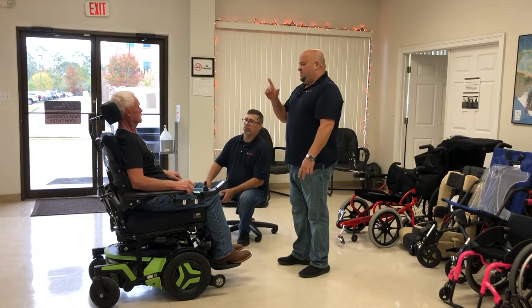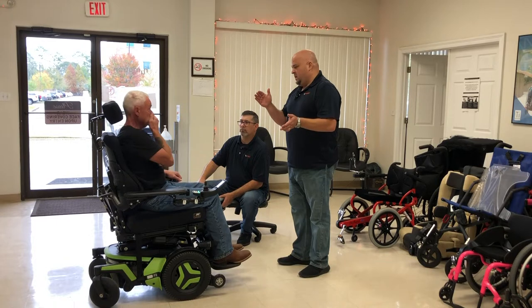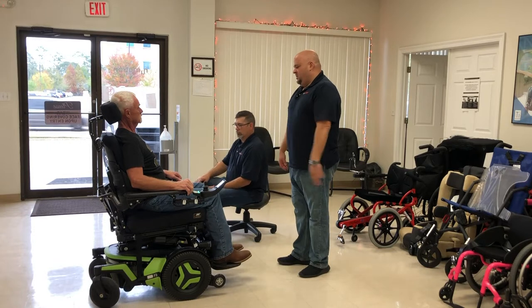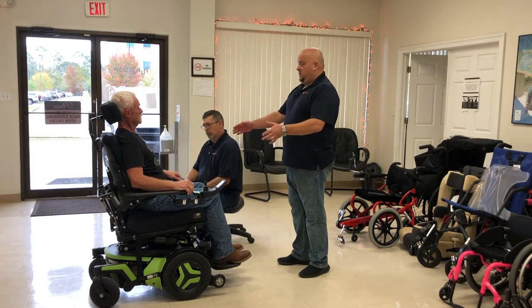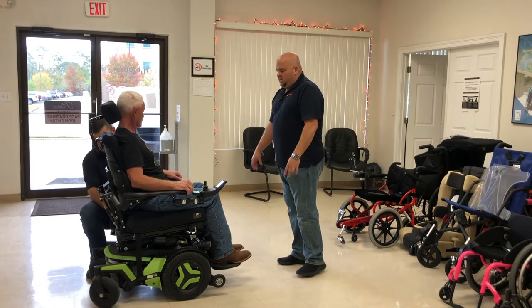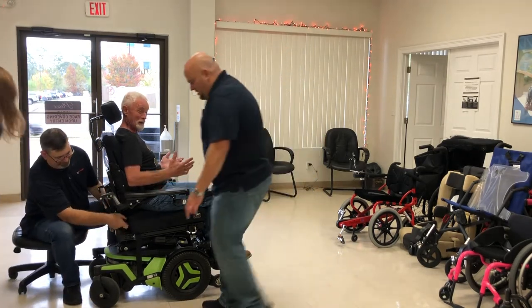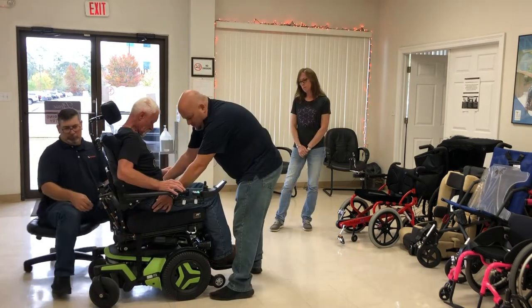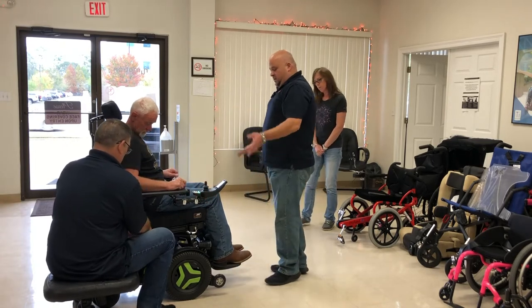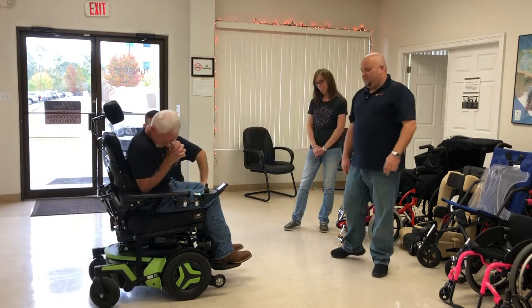With recline, you're going to get a little bit of shear in the back — the chair moves with you as you go down, but your pelvis still tends to slide forward a little bit. So let's adjust the belt and use it more as a positioning device to keep your butt back when you do that recline. It's also a safety device. You can't do wheelies without a seat belt! If it's not uncomfortable, leave that buckled all the time.